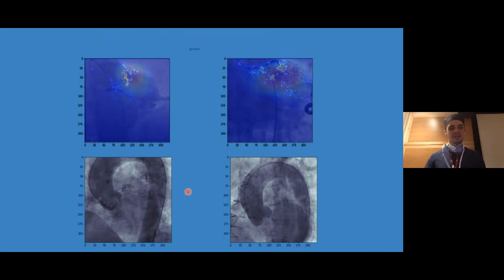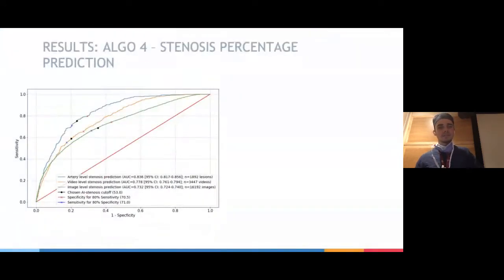And you can see here the pixels that are used in the prediction. We've done the same exercise, for example, for the aortogram, and not surprisingly, it's using part of the aorta to predict that this is an aortogram. So that's important to always double check that your AI algorithm is actually using the right data to predict your object of interest.